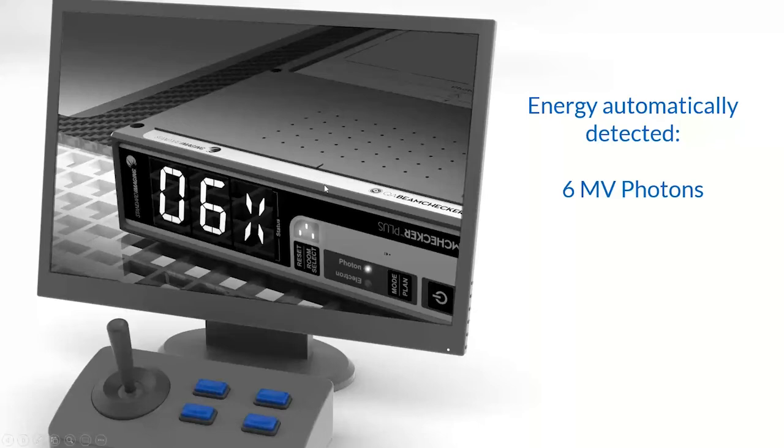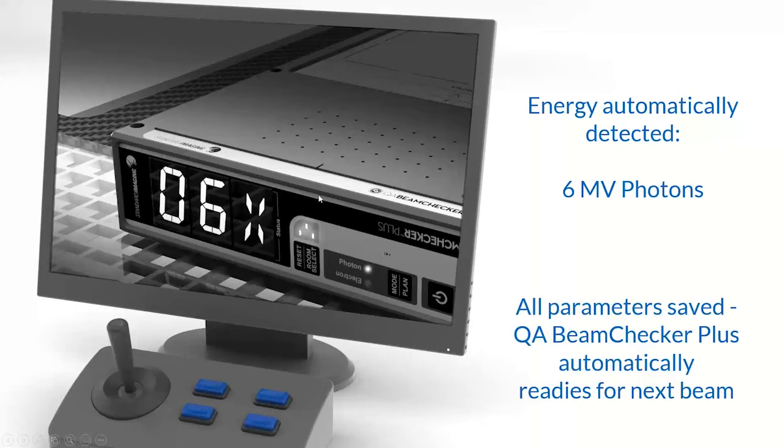And if that is within the action levels that you set during baselining, the device will simply store that data and indicate that it is ready to go for the next beam. You can then go ahead and shoot your next photon energy, and you repeat that procedure for photons and electrons as well.